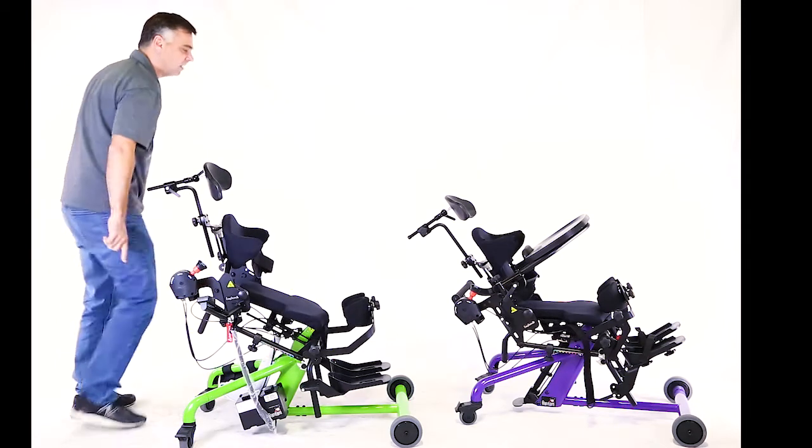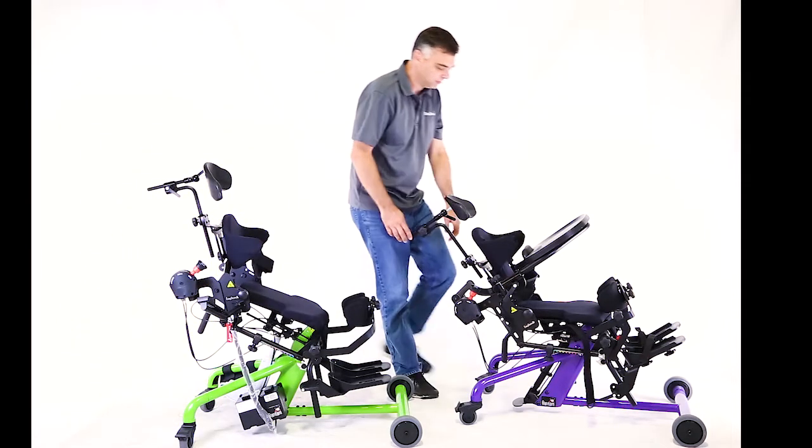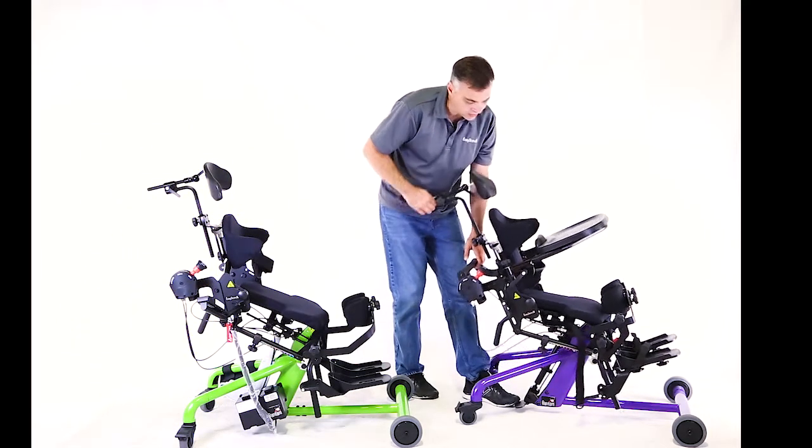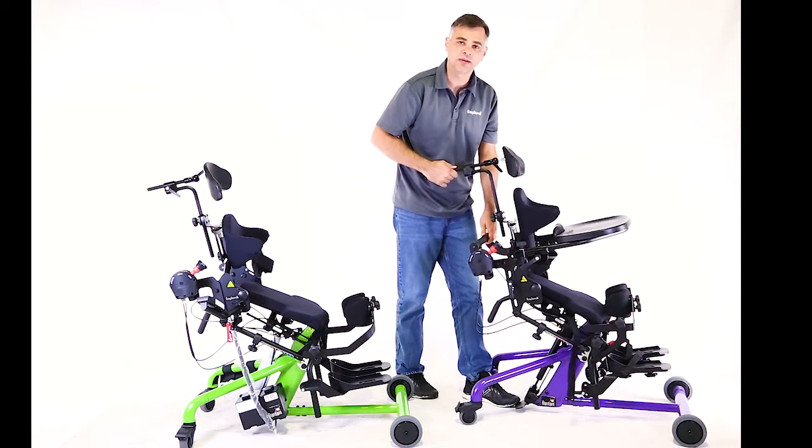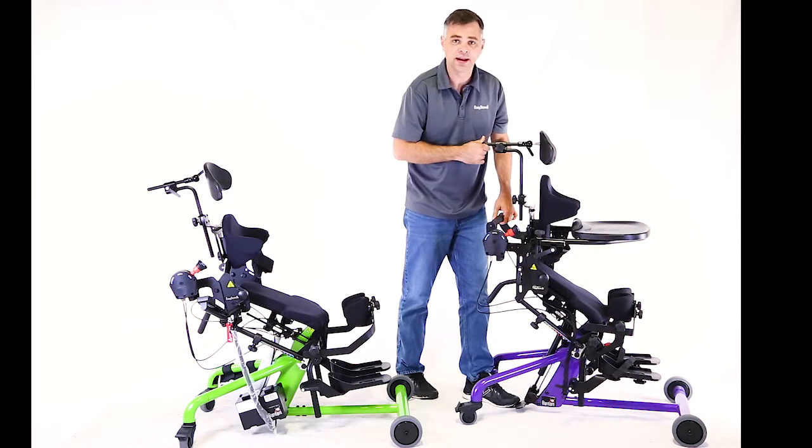I can do this exact same thing in the Bantam with the gas spring as well. I can go from sitting to standing. Now when I get to standing with the gas spring, it'll stop and I can't go any further.